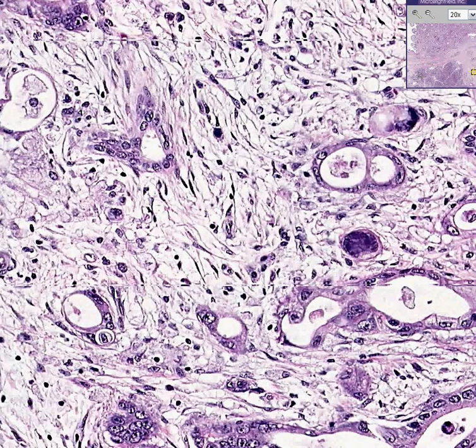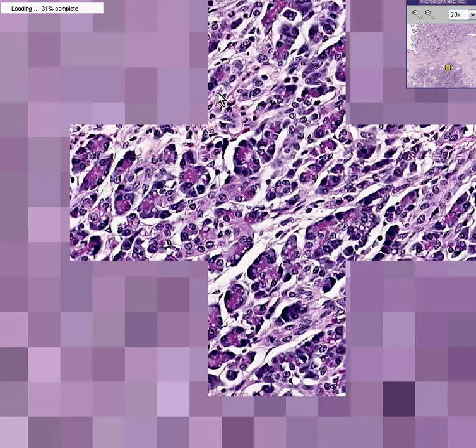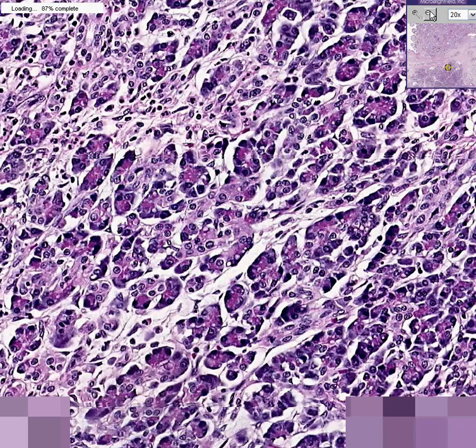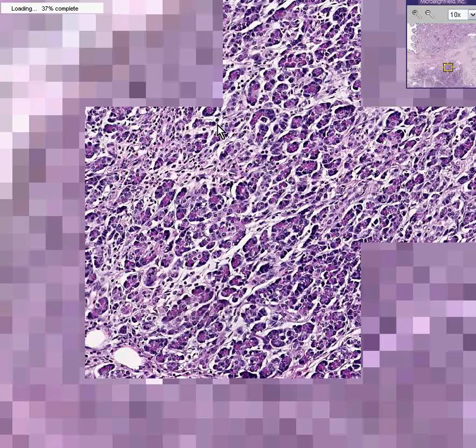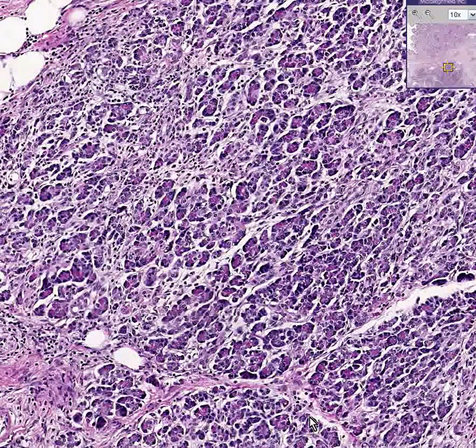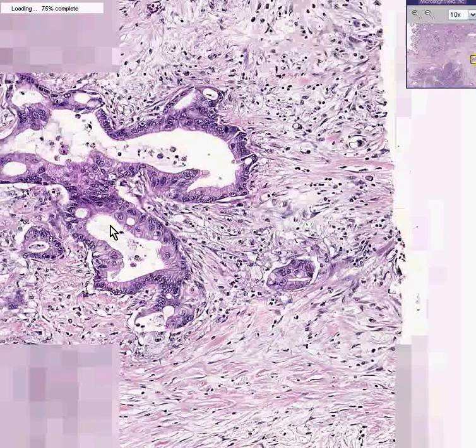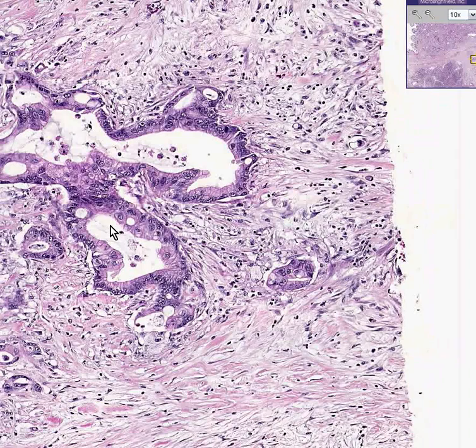pancreas carcinoma, ranging from the totally normal lobules that we have out here, nice and contained by these little septae between the lobules, having all the features of normal glands, all the way to this area out here, in which you see horribly malignant, irregularly infiltrating glands, evoking a very, very dense, fibrous response, sometimes infiltrating as glands, and sometimes, like perhaps here and here, and here and here, infiltrating as perhaps an individual cell or two. Thank you very much.